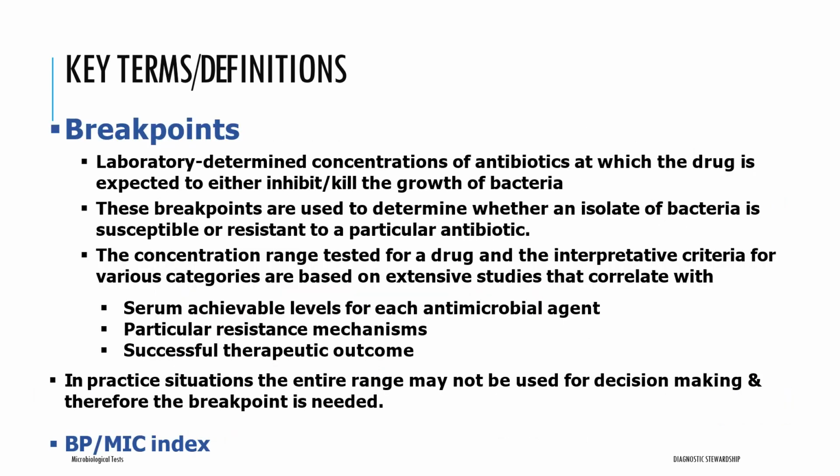Breakpoints. Breakpoints are lab-defined concentrations of antibiotics at which the drug is expected to either inhibit or kill the growth of bacteria. These breakpoints are used to determine whether a bacterial isolate is susceptible or resistant to a particular antibiotic. The concentration range decided for a drug and the interpretation criteria for various categories of antibiotics are based on extensive studies that correlate with the serum achievable levels, particular resistance mechanisms, and successful therapeutic outcome. Practically, the entire range may not be used for decision making. Hence, the breakpoint is needed for categorizing the MICs. The most important is the susceptible breakpoint to MIC ratio, which is used for the selection of the antibiotic.